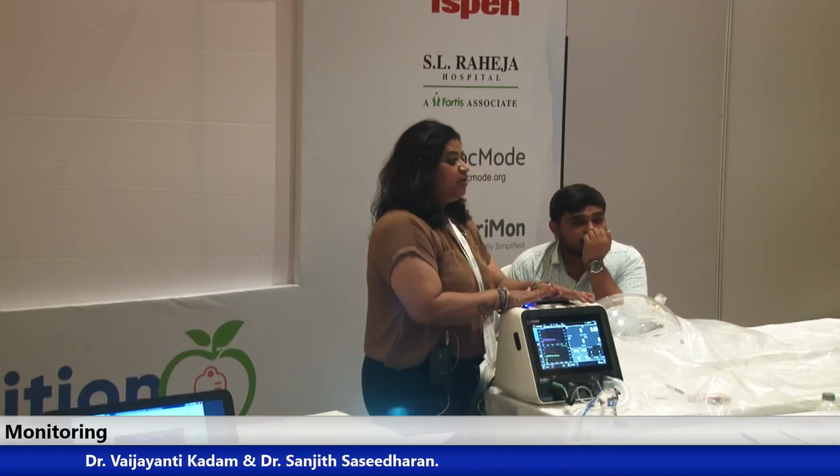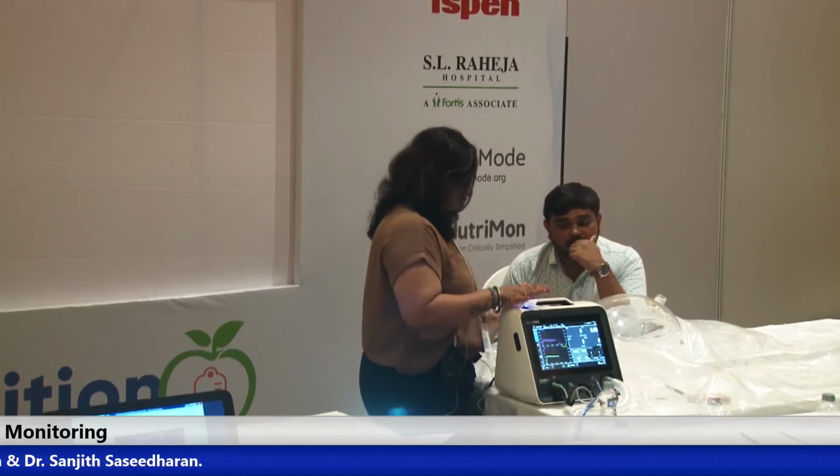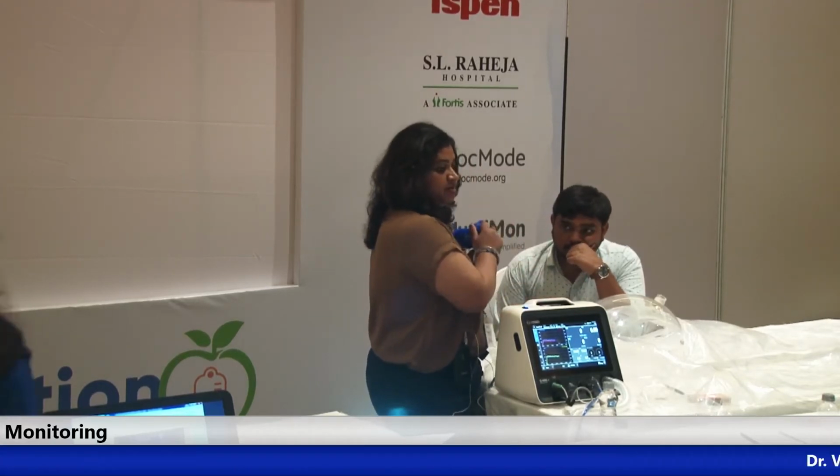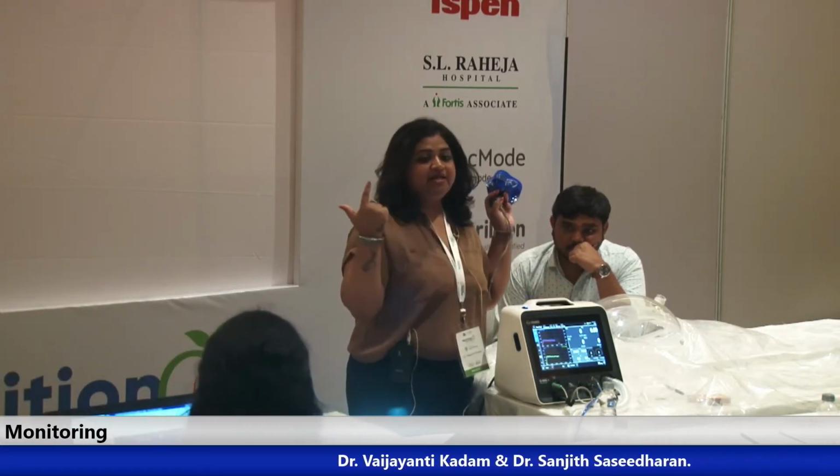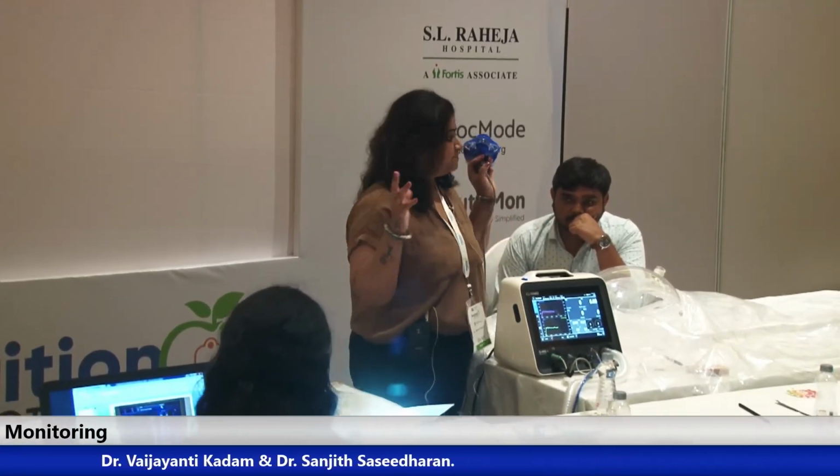So the moment we connect this patient to this machine, it will start auto calibrating and it will start giving results in no time.